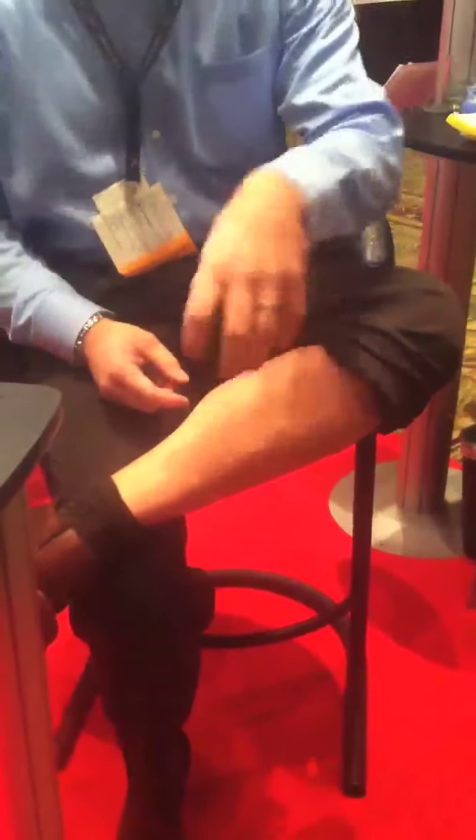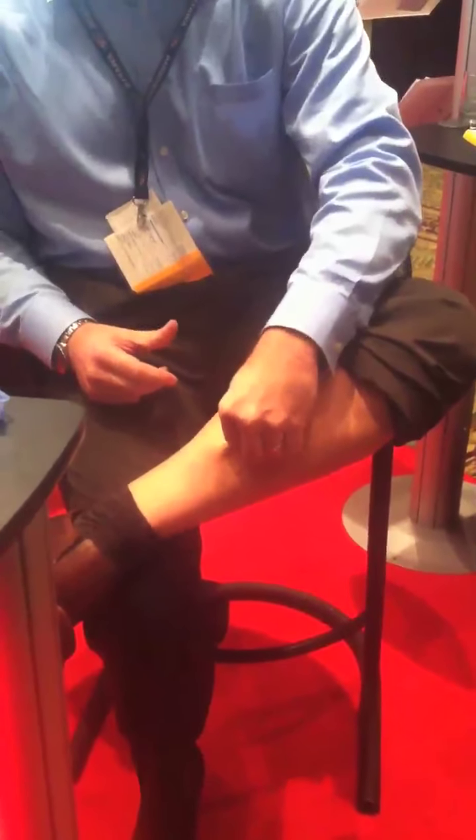So if I have a bleeding wound here, I open up the package and take it out. You can see it's got those needles. I apply it to the wound, center it, and just squeeze it through the box. That's it.